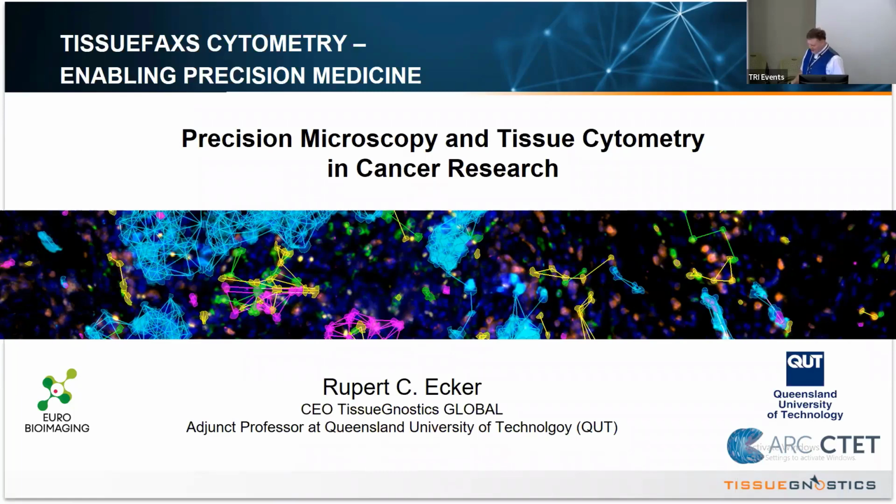I developed a technology that brings the idea of flow cytometry, so quantification of antibody-mediated staining on the single cell level, from suspension to tissue section. And this is what tissue cytometry, also called tissue image cytometry, is referred to.